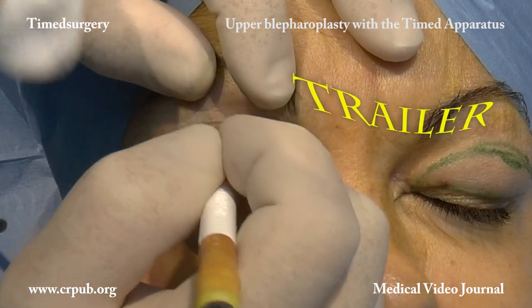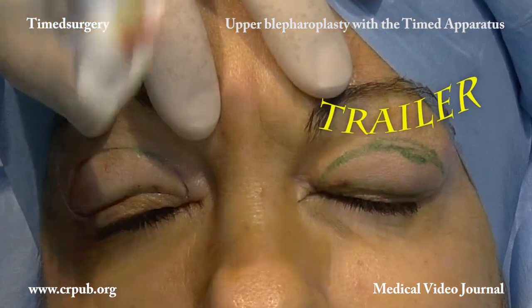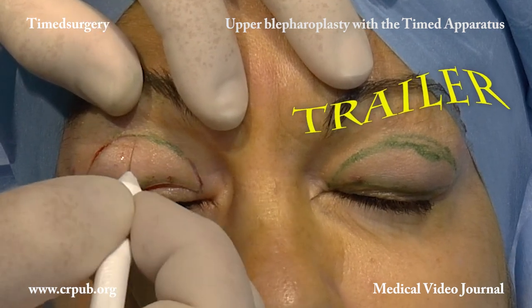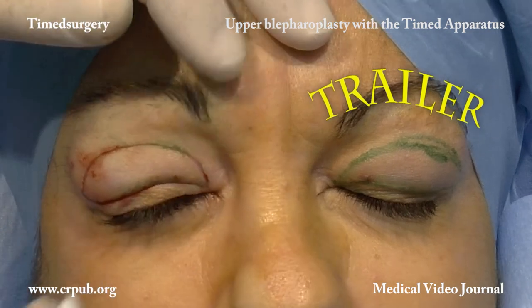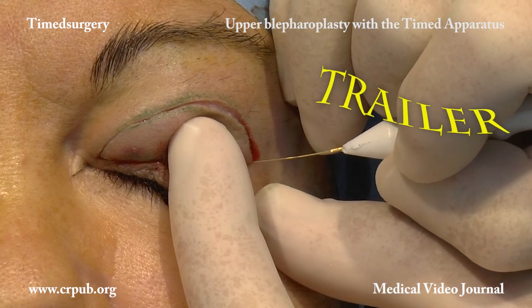Timed surgical cutting enables the skin to be incised without being burnt. This is done by exploiting the characteristics of the programmable current generated by the timed apparatus and the exclusive triangular-tipped conical electrode.